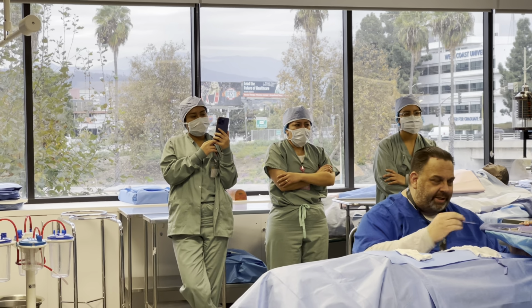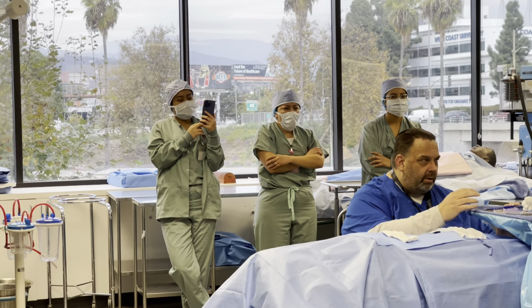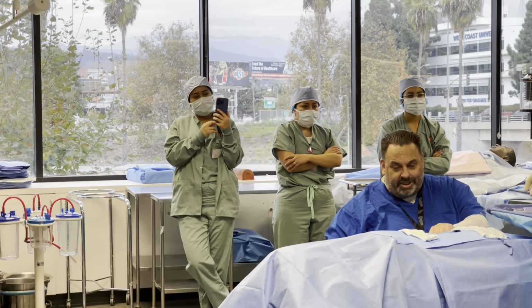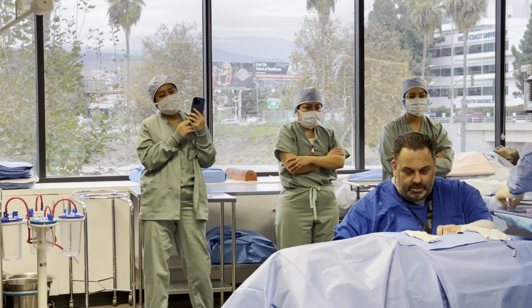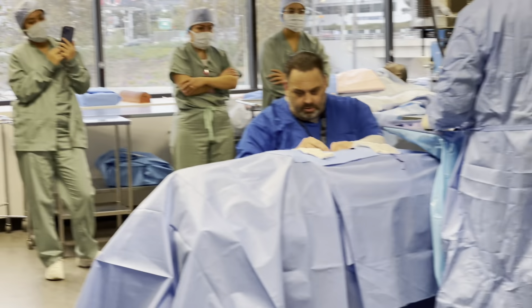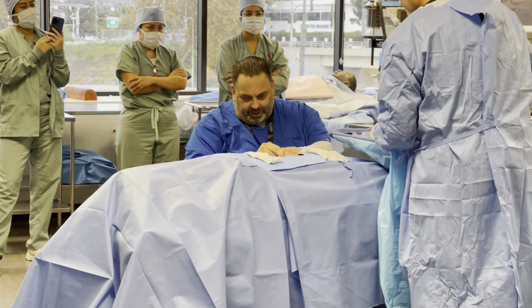First I gotta mark the surgical site. What percent lidocaine with epi? Whenever you use your medication, you must tell me what it is. Do you have a good date on it? So far I have.